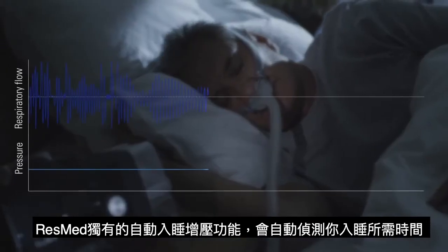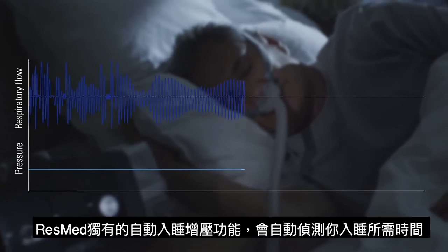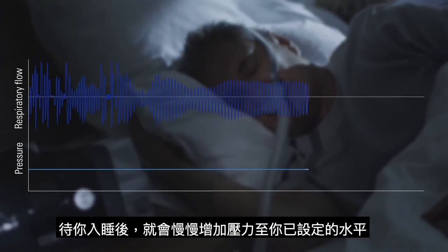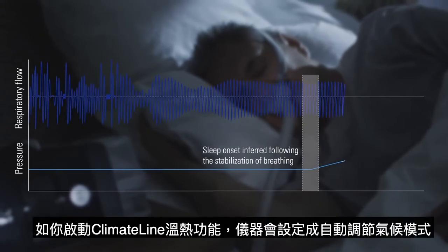ResMed's new AutoRamp feature with sleep onset detection helps make therapy comfortable from the moment you press Start. It works by delivering a low pressure to help you fall asleep with ease, then comfortably increases the pressure to your prescribed level the moment you fall asleep.